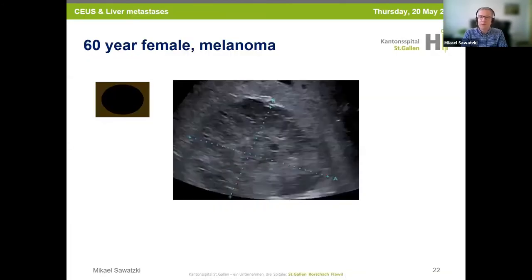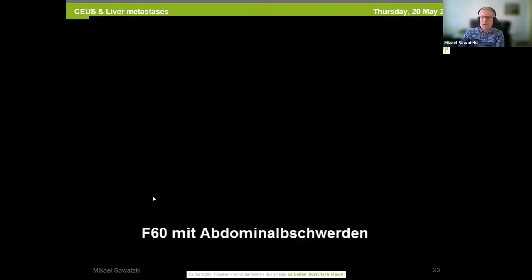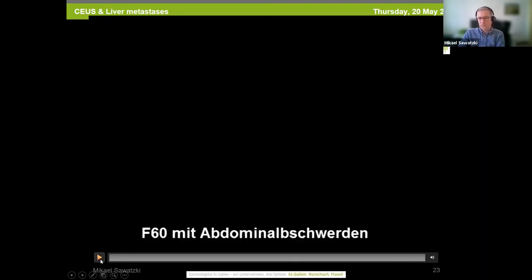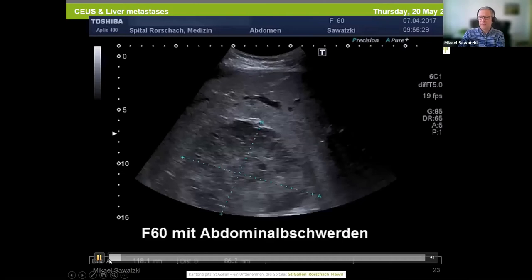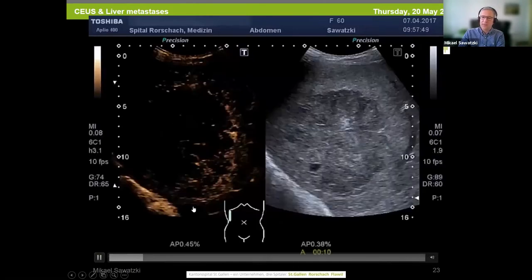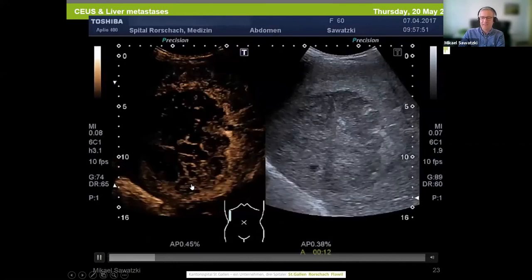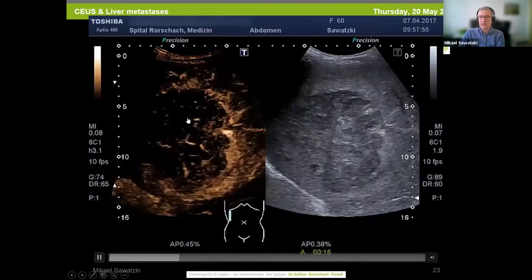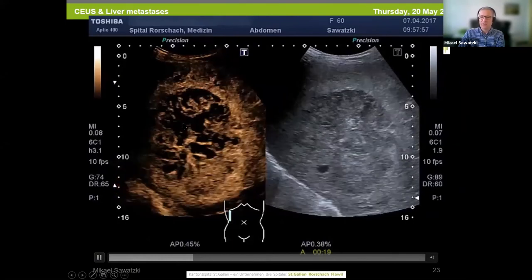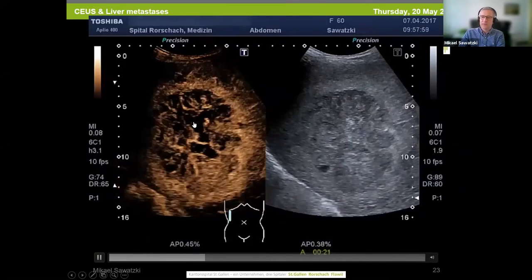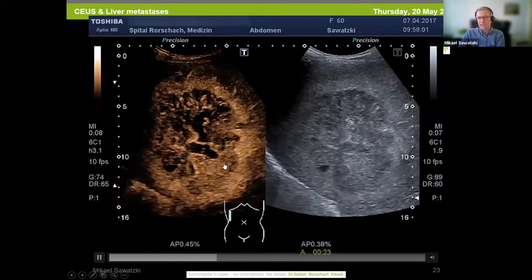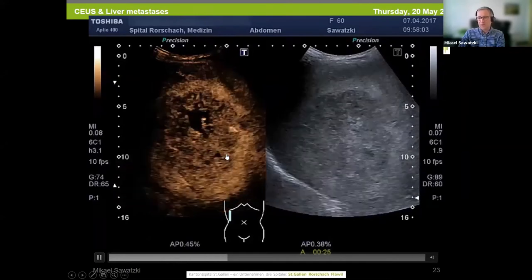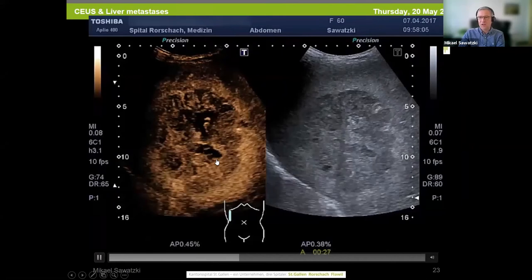This is an example of a 60-year-old female patient with malignant melanoma and abdominal pain, with a 12 cm inhomogeneous liver lesion in the right liver lobe. You see neoplastic chaotic vessels in the arterial phase. The dark area is necrotic avascular tissue. After 30 seconds you see washout at the edge.